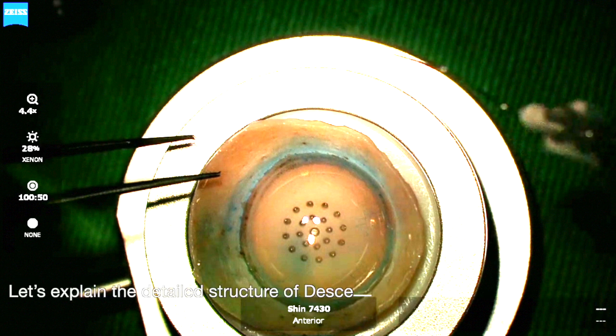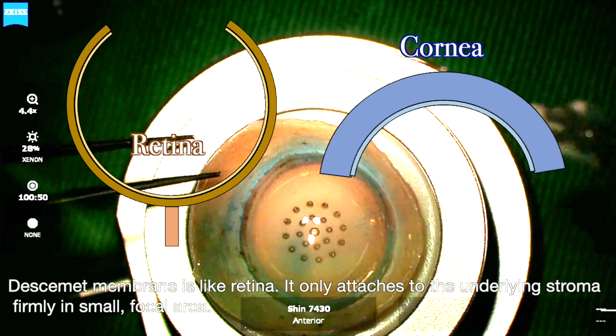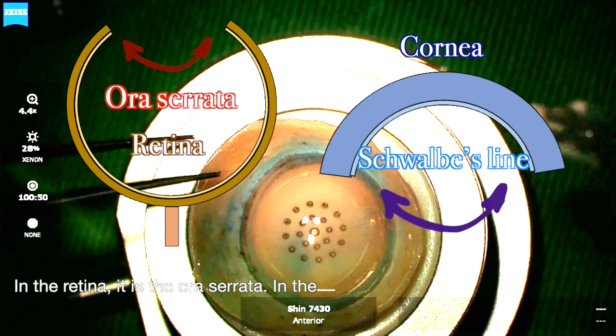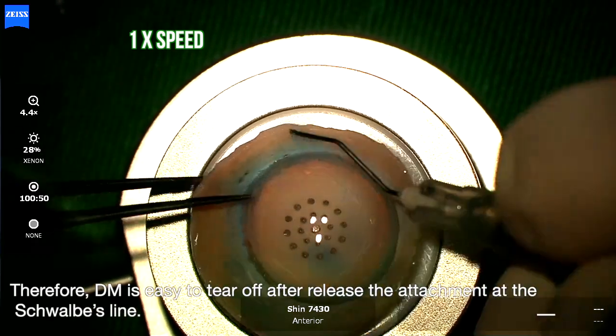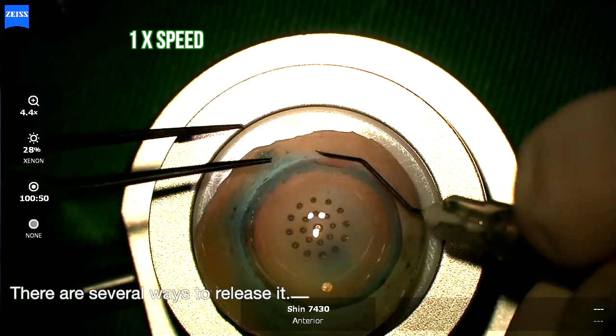Let's explain the detailed structure of Descemet membrane before we start. Descemet membrane is like the retina. It's only attached to the underlying stroma firmly in a small focal area. In the retina, it is the ora serrata. In the cornea, it is Schwalbe's line. Therefore, Descemet membrane is easy to tear off after releasing the attachment at Schwalbe's line. There are several ways to release it.